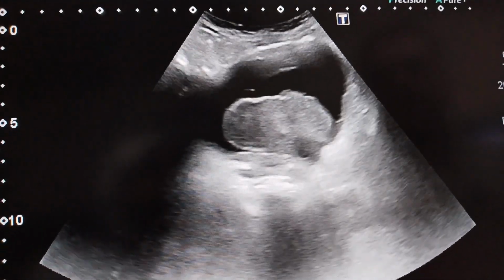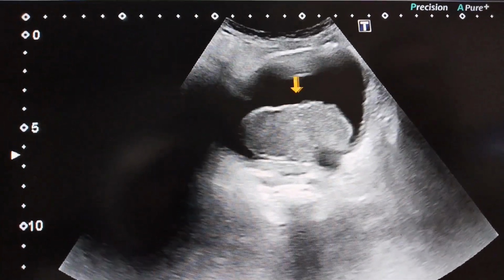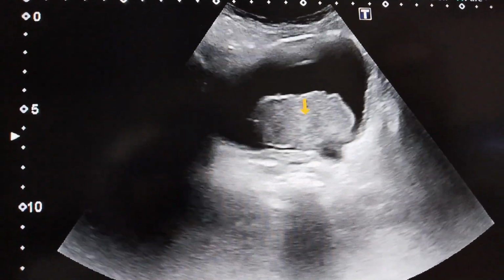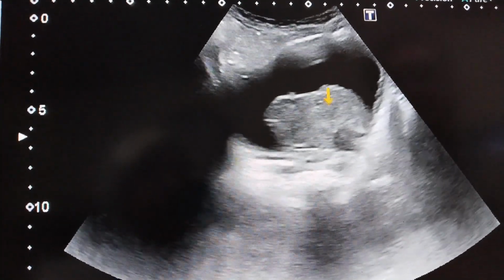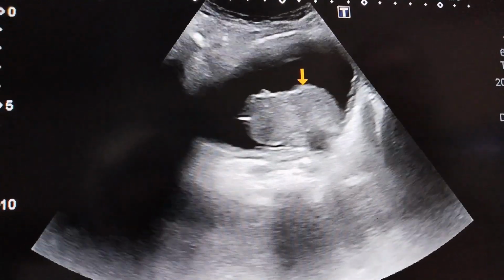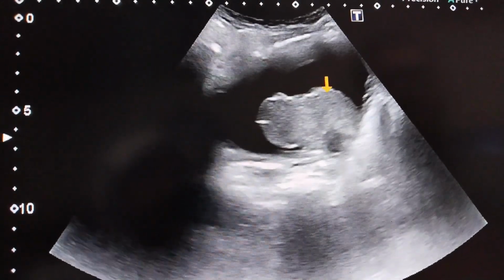Here we can appreciate that this is the urinary bladder, and here we can appreciate the mass. This mass is hyperechoic, and it is irregular in shape with an irregular border.